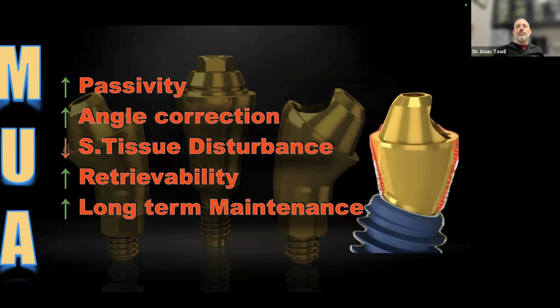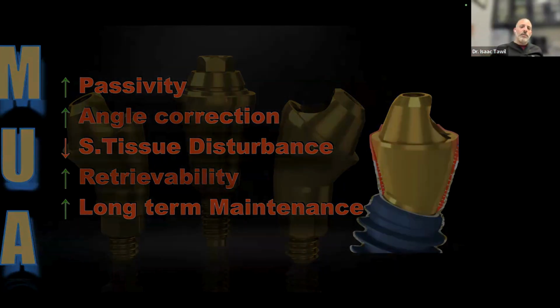They're not terribly expensive, and it's easy to get them out. If these screws break, I can get them out. Or if the multi-unit is damaged, I can change the multi-unit. It's kind of my fail-safe. So for those that like to go direct to implant, I just feel like they haven't done enough implants and they're worried that maybe they can't do an FP1 restoration. We do FP1 restorations all day long. Fixed prosthetic one, white teeth, no gingival replacement, all day long.